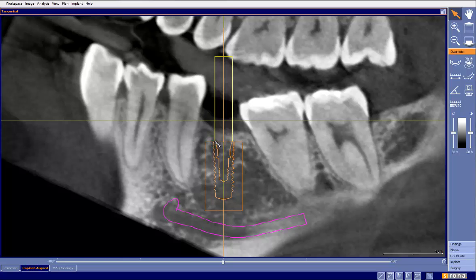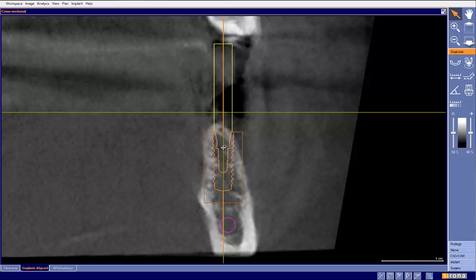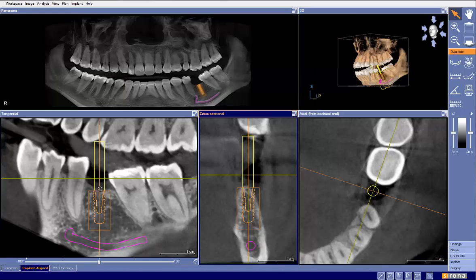So one, if that were the level of the implant, here's what our restoration would look like. And with the implant this deep, now we have all of this area right here and all of this area right here for there to be a food trap, given the limitation of this molar right here. So I would have a tendency not to bury this implant right here. I would want to go ahead and bring the implant up. Again, this is going to expose threads, but we want to do the right thing. So now when I bring the implant up, I have a better ability to adjust the contours.